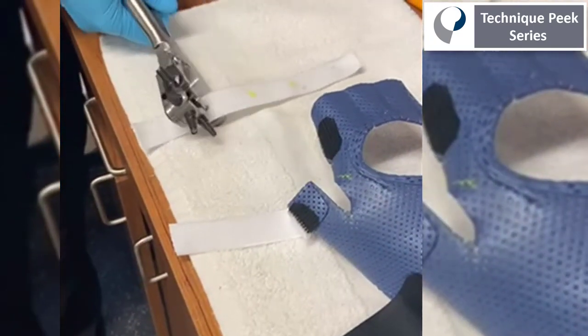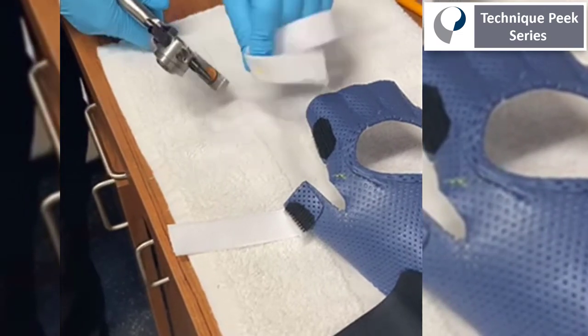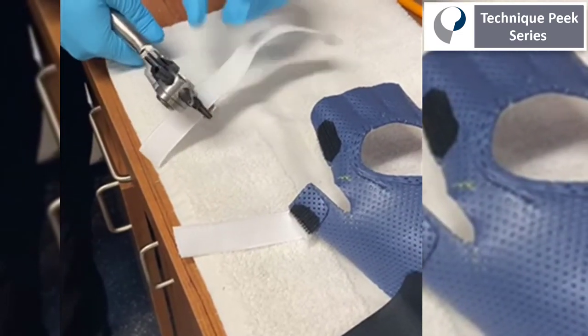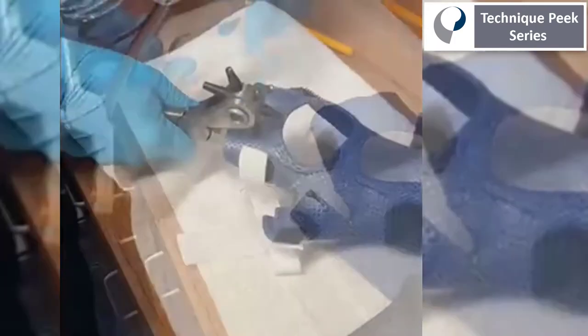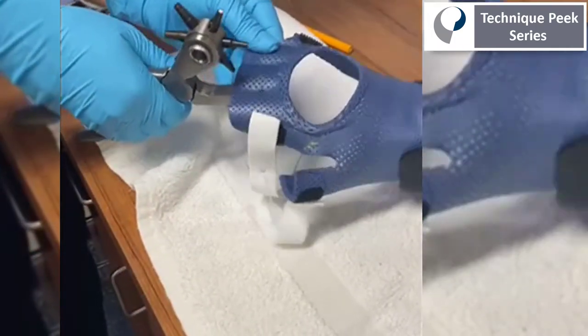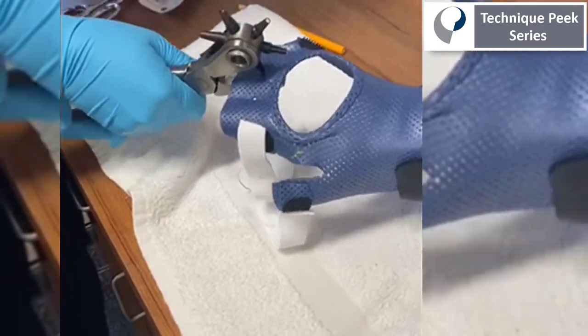One inch thick. I'm using the hole puncher to differentiate between each finger, so I'm going to line that up with the splint material, and poke holes corresponding with those holes I just made in the strap in between each digit.